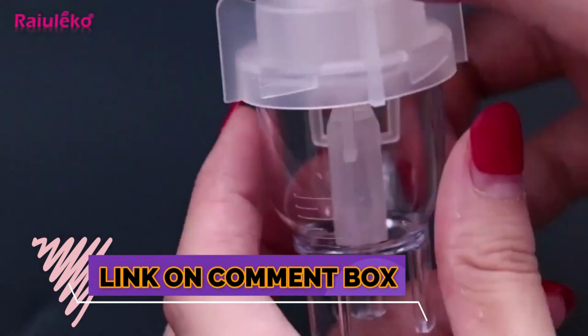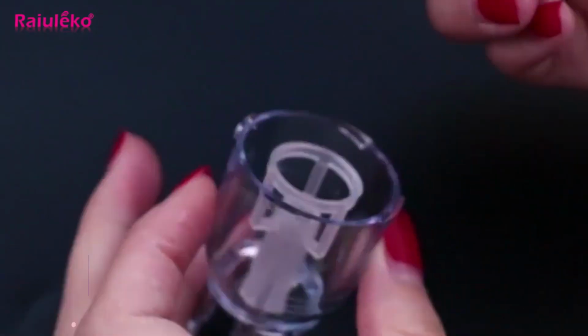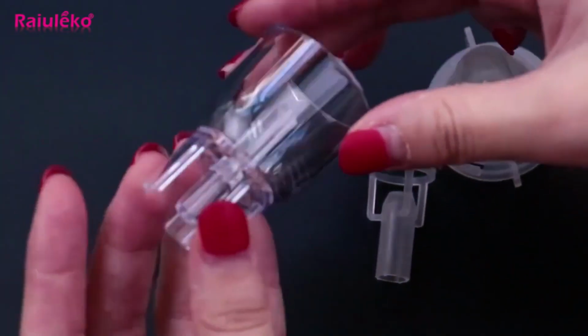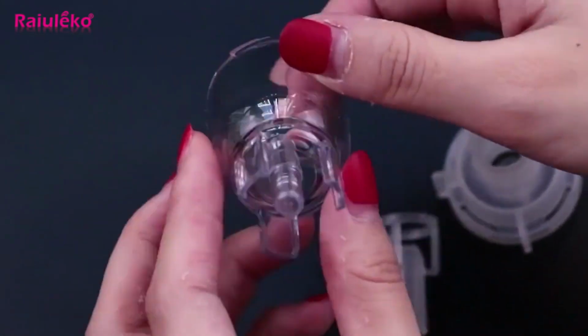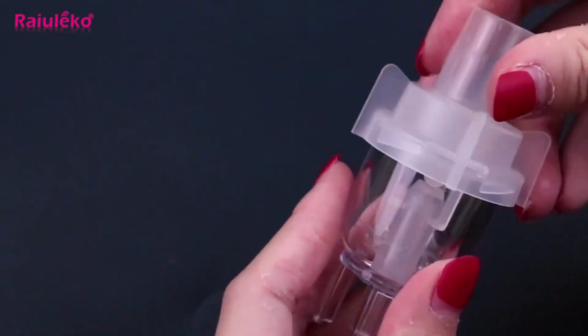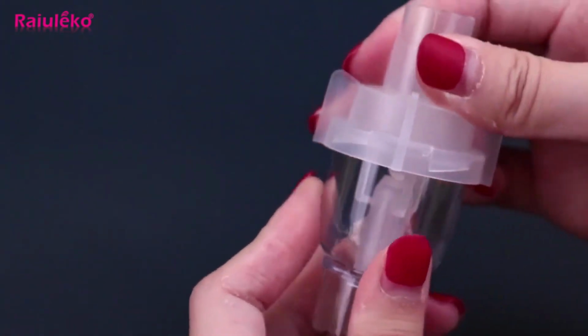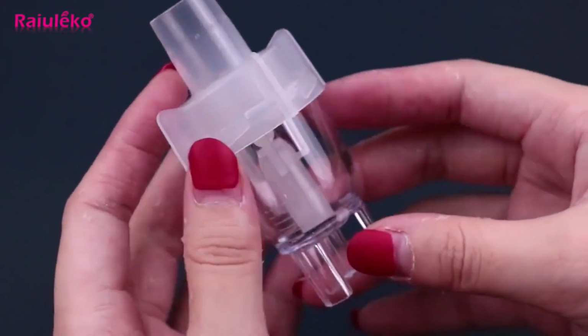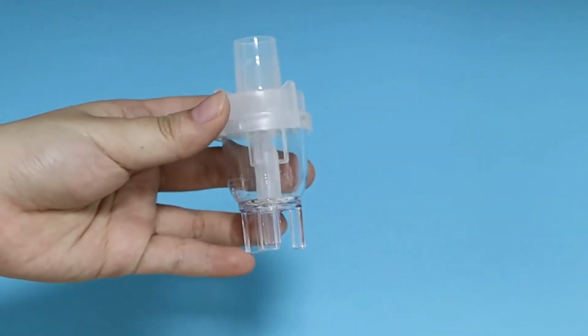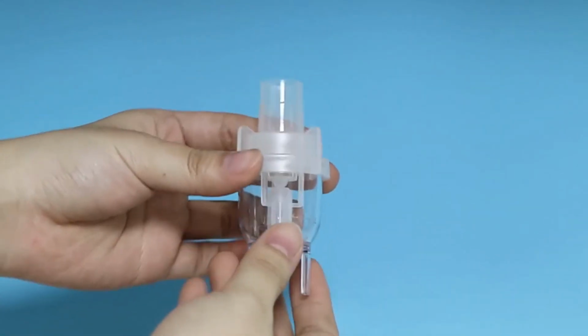An atomized nebulizer is a device that uses an airstream to atomize medication and deliver it directly to the lungs. This helps improve absorption by increasing the surface area and reducing the need for oral medications. They come in various types and are commonly used in hospitals or clinics to disperse medication throughout the respiratory system. A nebulizer is a medical device that turns liquid medicine into aerosol that you inhale directly into your lungs.